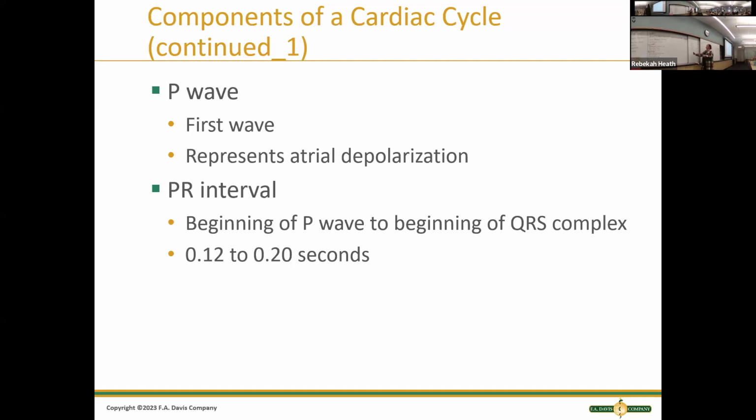When we measure our QRS complex, you're looking for that isoelectric line again. We got through the P wave, and we're back to isoelectric. The point where we see it deflect either up or down, to when it goes back to the isoelectric line, that's what we're measuring.